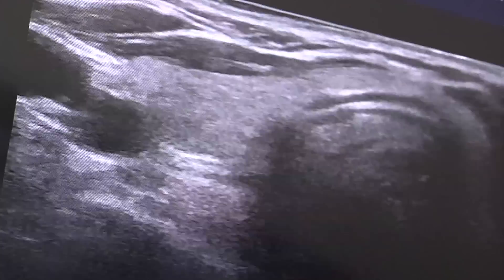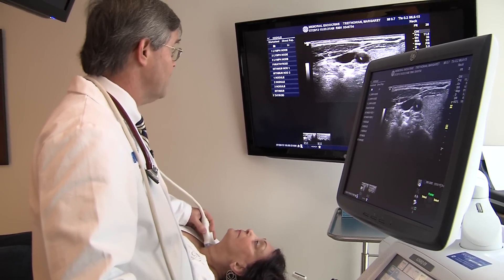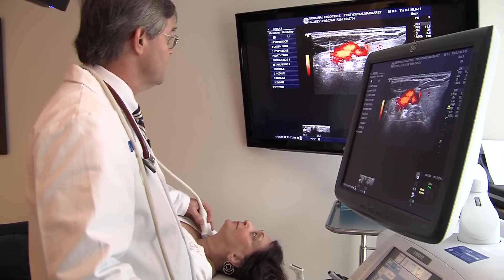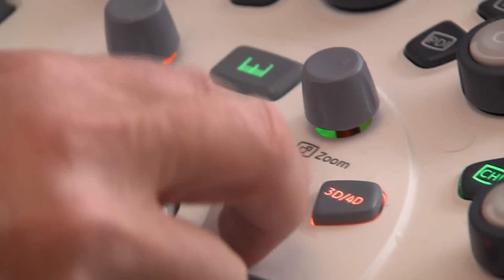This right here is your jugular vein — you can see it move as your heart beats. This is your carotid artery. I can even show you blood flow inside those two things. There's the blood flow, which is good. And here's a normal lymph node — I'll show you what a lymph node looks like. This thing right here is a lymph node, and it is normal.